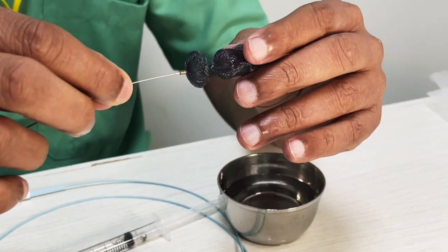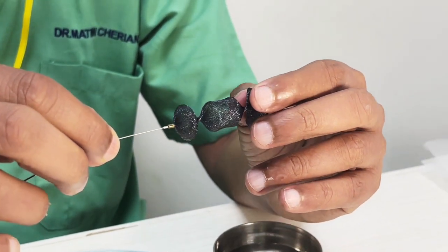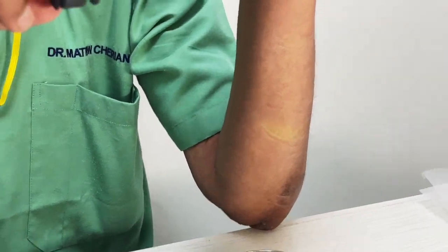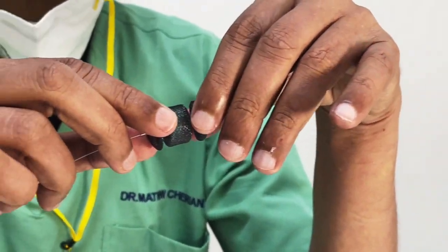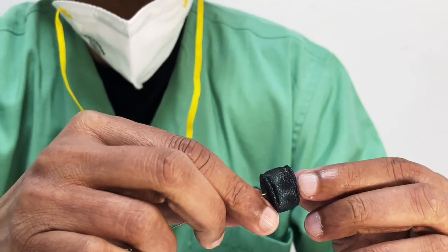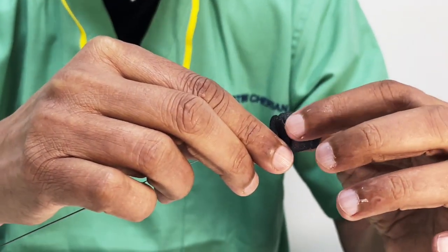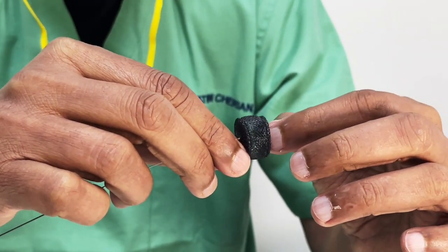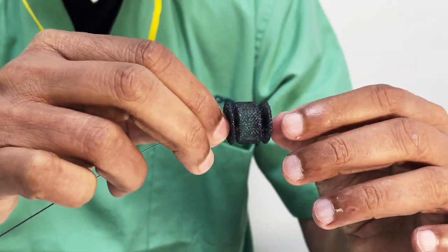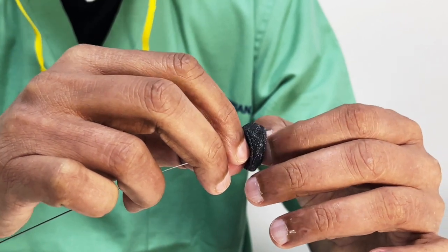Now you've got some Chinese products also coming to the market. They're a little more rough, but also do the same job. This is the same device that you use in all kinds of places. This is the Amplatzer occluder. If you have just two discs and the center is missing, it becomes an ASD device. Imagine you have just two discs like this, nothing. So the ASD device is the same thing without a central piece. The VSD closure device is also the same thing without a central piece, because it's just two discs coming and fusing together. Have you got it?